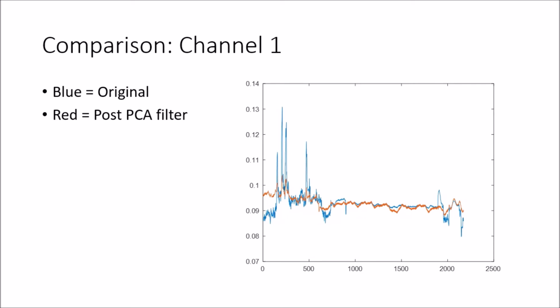Anyway, I hope this helps explain what this filter does. Of course, there's more videos on the actual raw statistics side of it, but I do hope it was helpful.